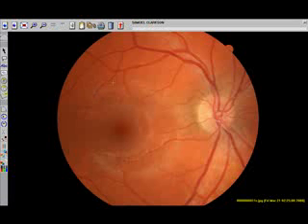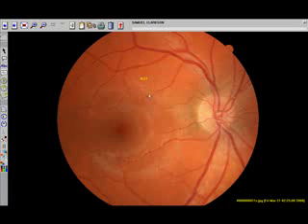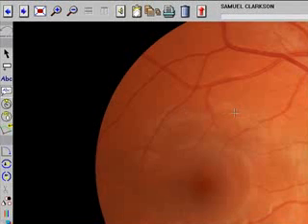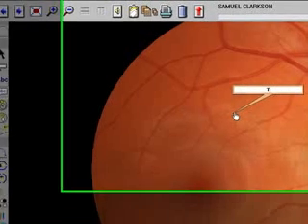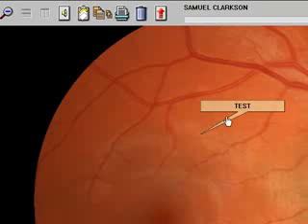To annotate an image with a word, press on the ABC. Type your text. To annotate with a word inside of a balloon, type the text, left-click on the screen, and drag the tail to point to the pathology.